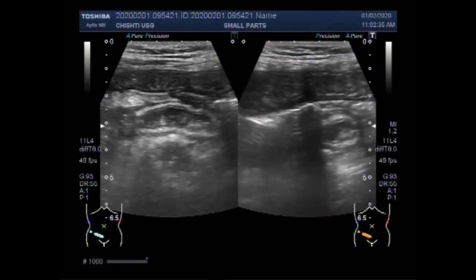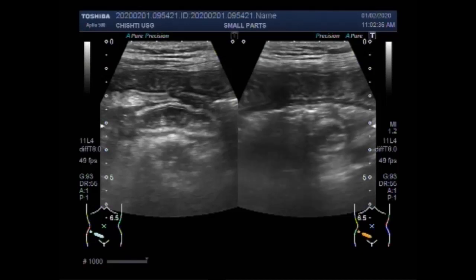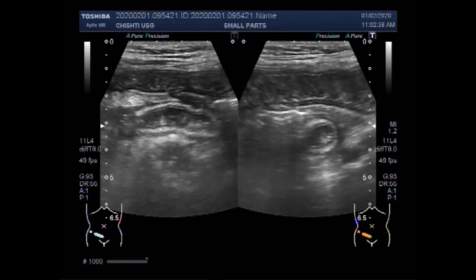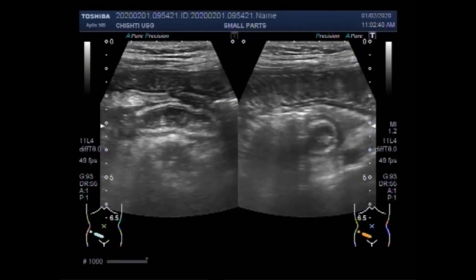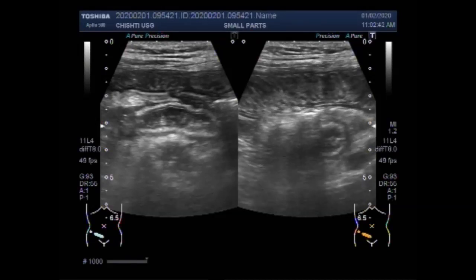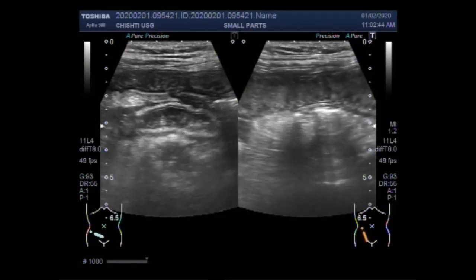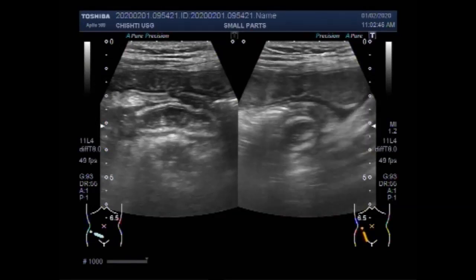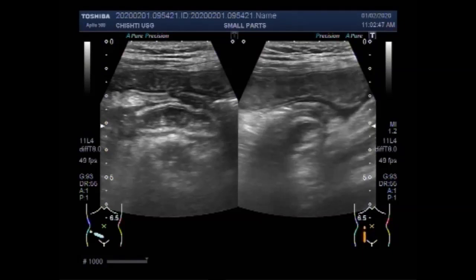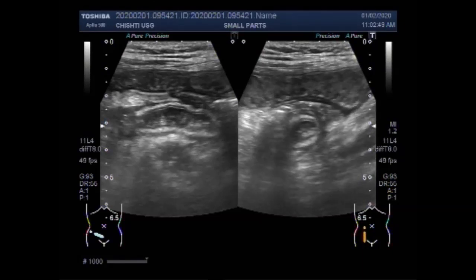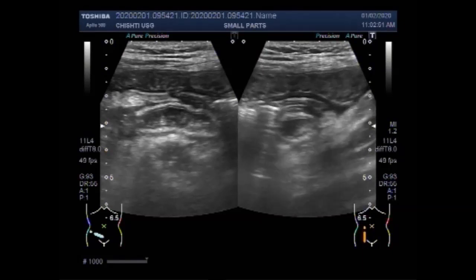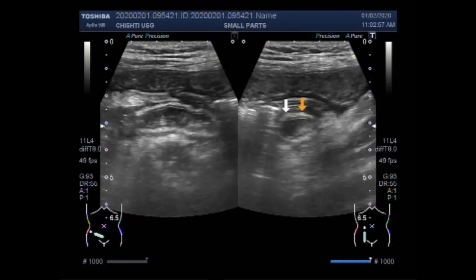This area is extremely tender and the patient experiences intense pain. Now again you can see the transverse view, and the picture on the left side shows the longitudinal view of the acute appendicitis.